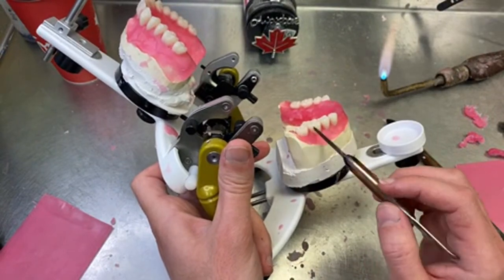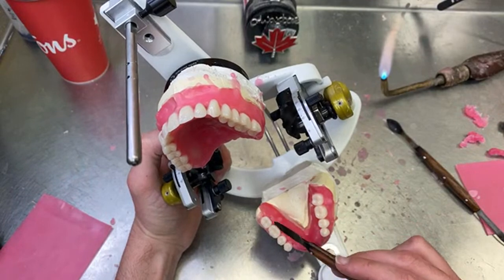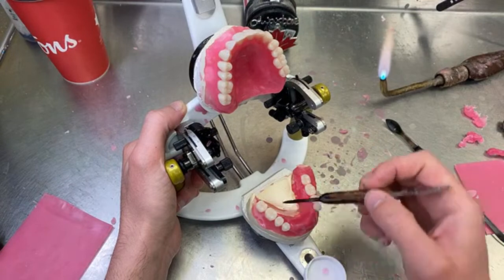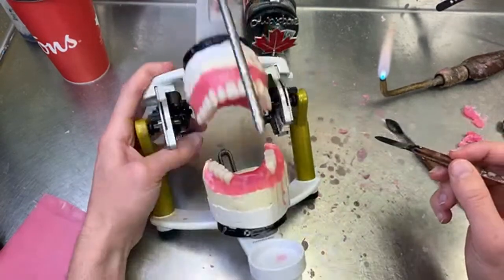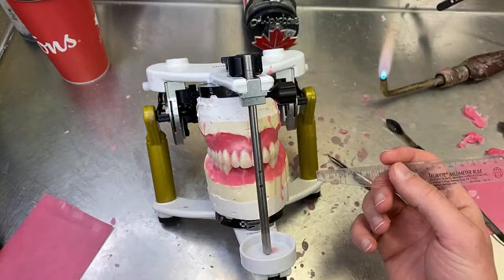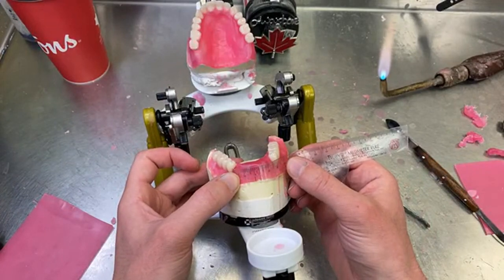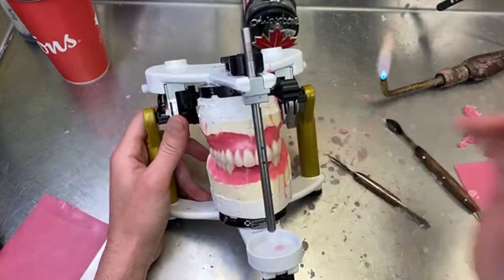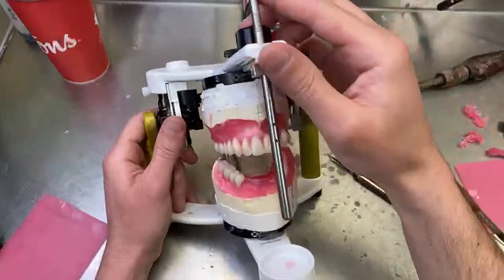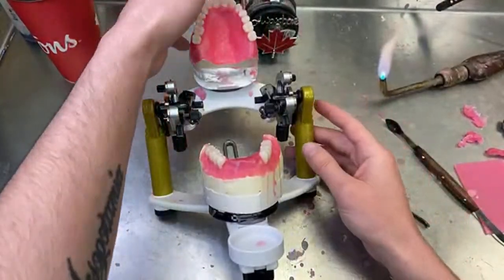So there you have it. That's setting up an upper and a lower. Then you put the anteriors here based on the space that you have. You pick the correspondent teeth and then you'll see how much space you have with something like that. So I'll need something like around 40 millimeters on that one. Oh yeah, that slab is, you know, it's good. So yeah, there you have it. That's setting up a lower and an upper.